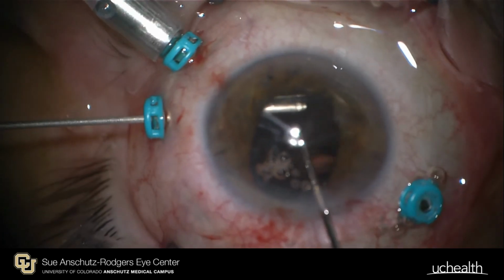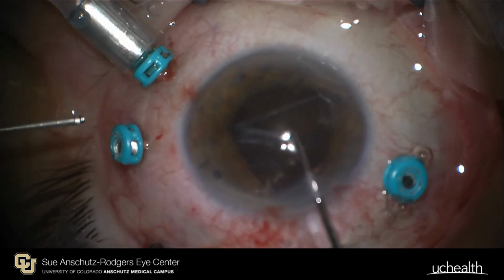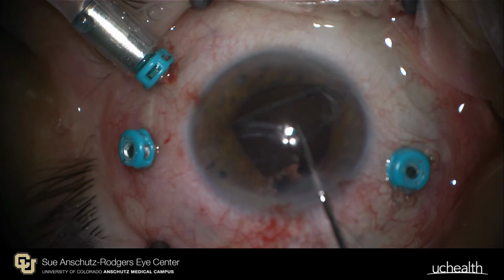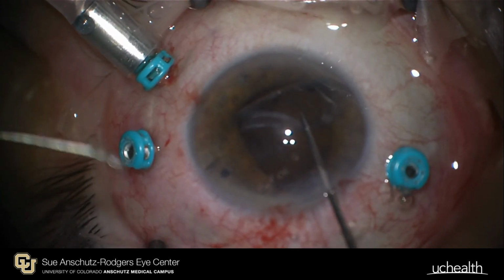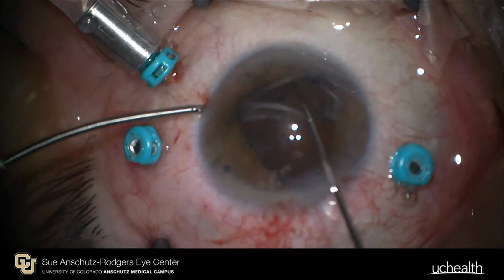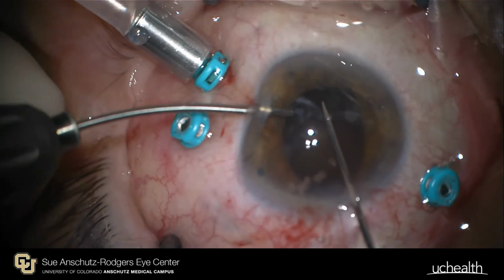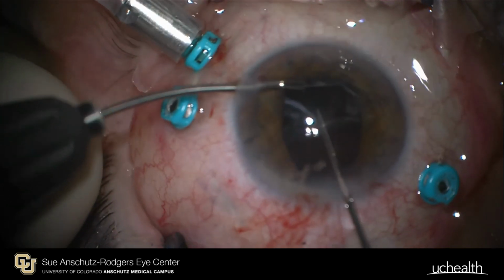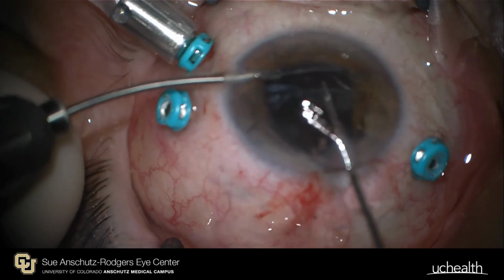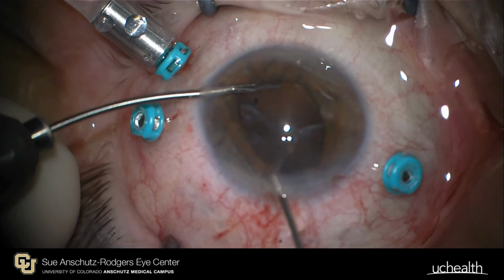A vitreous cutter was then planned to be used to remove the zonules with a second hand. However, instead, the capsular tension ring was noted. With the second hand, forceps were used to grasp the CTR. Then, the same intraocular scissors were used to cut the CTR. Forceps were then used to rotate the CTR out of the eye.